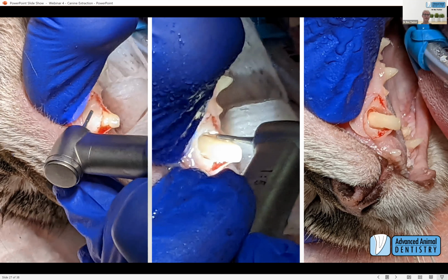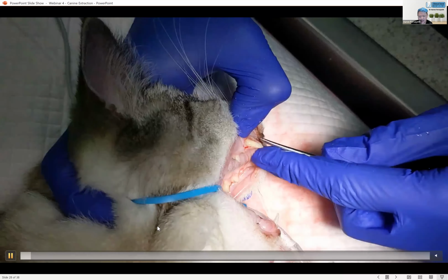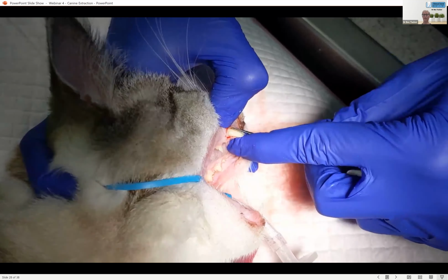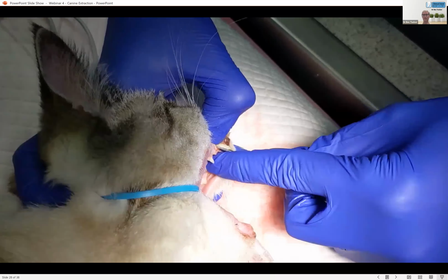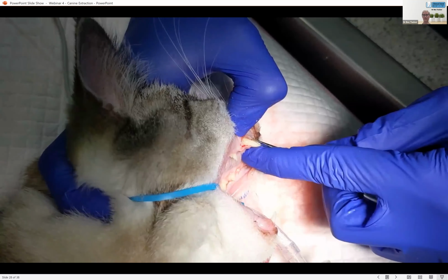So that's just a series of pictures, and I guess again the one on the far right is probably the most useful and important. And again, you can see that moat around the tooth there. So not the whole root's exposed, but the top 30-40% of that is. And now we can fit an instrument in that area. I think that's a little 3 millimeter, that one. So again, not really quite doing what I want. So in that case, if it's not grabbing, what I'll do is just go back in and deepen those moats around the tooth. So I can deepen those a little bit now.